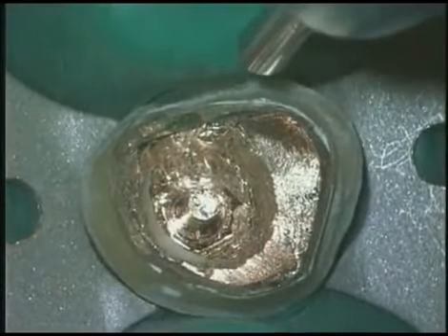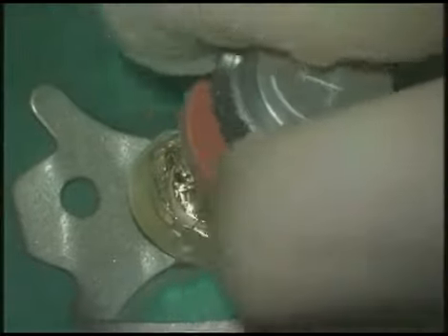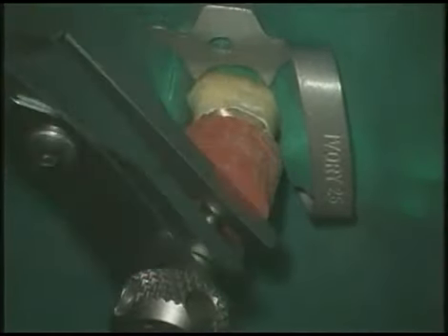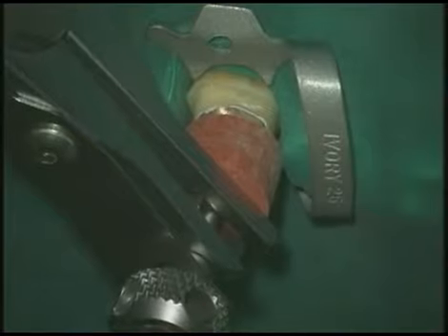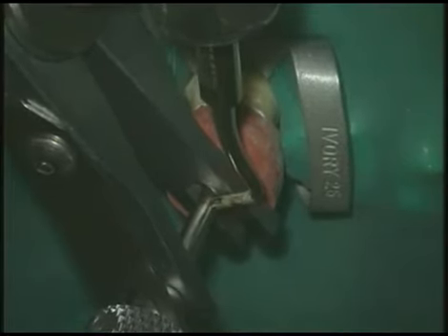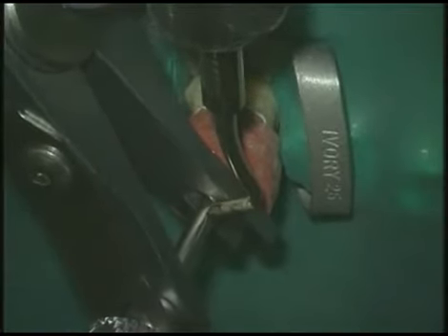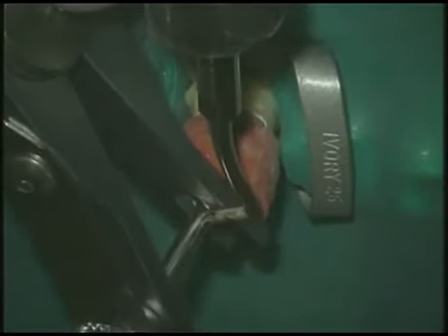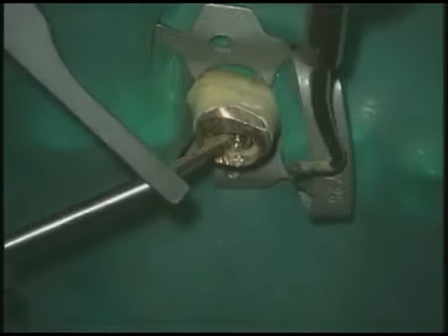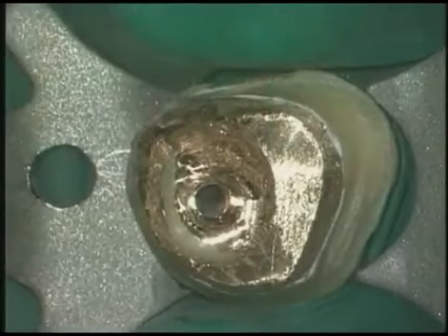Very easily we can tap these in the usual manner using protective bumpers to cushion the top of the tooth from the removal loads. And sometimes multiple bumpers are employed to protect adjacent teeth or to properly get the plier in position in posterior roots. Ultrasonics is commonly used, as you've seen, with the post-removal system because it enhances the removal. Once the palatal post is removed, we're going to have a great shot in through the core looking down into the palatal root.